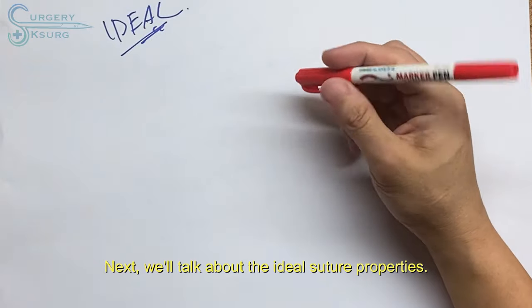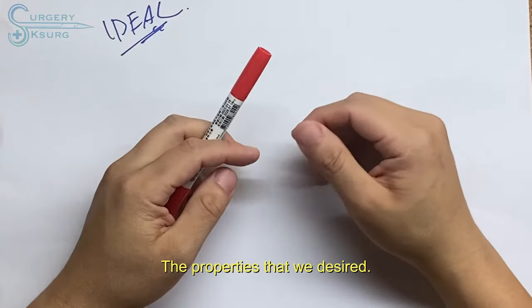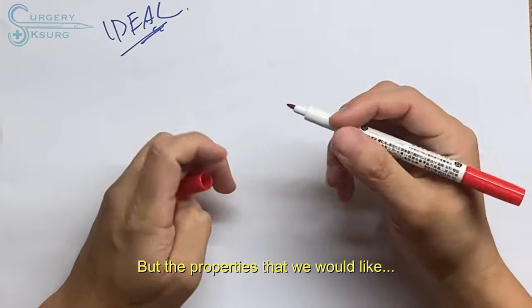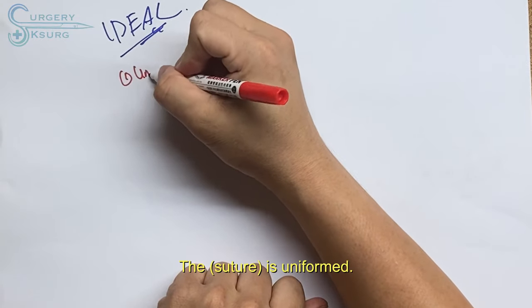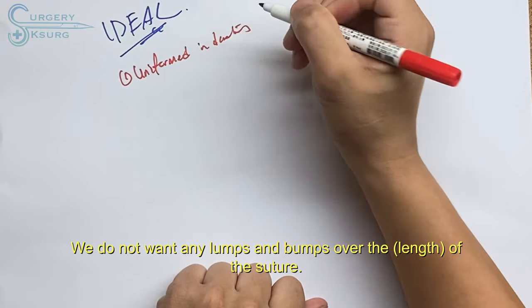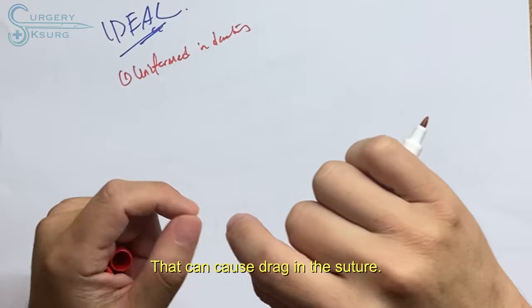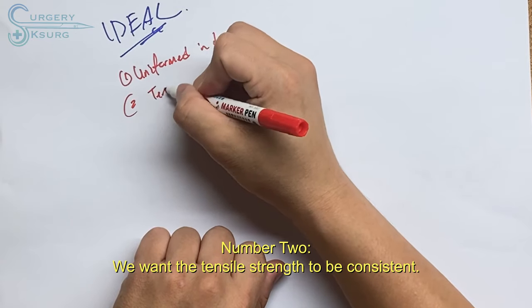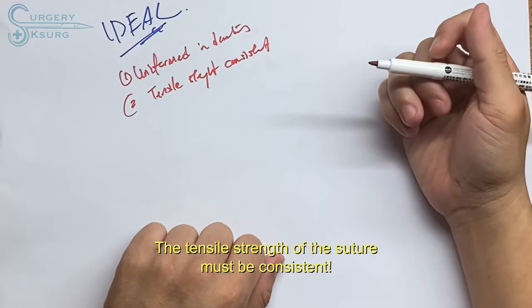So next, we'll always talk about the ideal suture properties, the properties that we desire. It's like a dream girl. You can dream of it, but it never exists, all right? But the properties that we like in a suture: number one, the suture is uniform. You must have a uniform diameter. We do not want any lumps and bumps over the suture that can cause any drag. Number two, we want the tensile strength to be consistent. The tensile strength of the suture must be consistent.